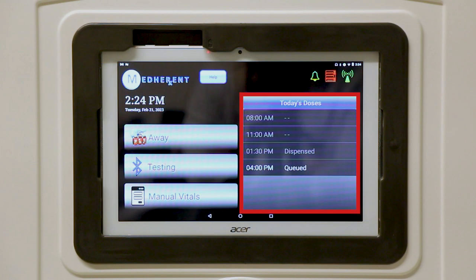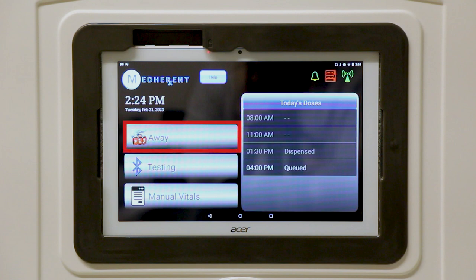On the right of the screen, you'll see a section labeled Today's Doses, which serves as the heart of the MedHerent system. Sometimes multiple days' worth of medication will need to be dispensed in order to prepare a patient or client for a leave of absence. MedHerent's away mode is designed to address these leave of absence situations. In the vast majority of situations where the away mode is needed, caregivers will be responsible for using this functionality and patients should refrain from pushing the away button.